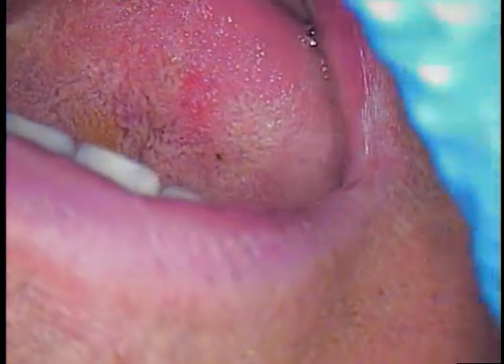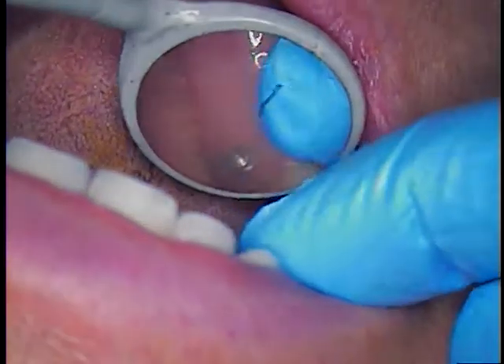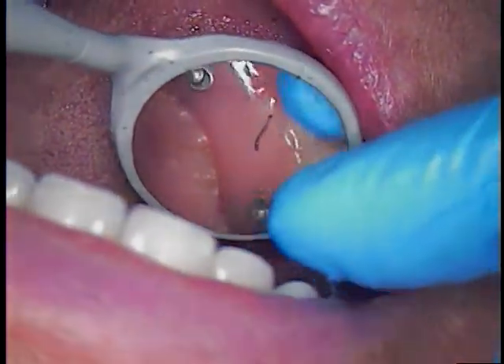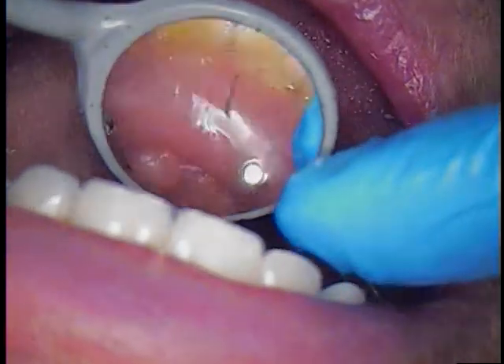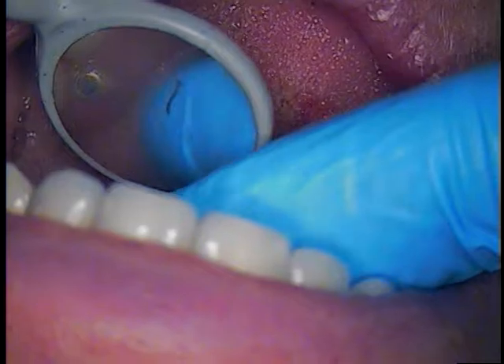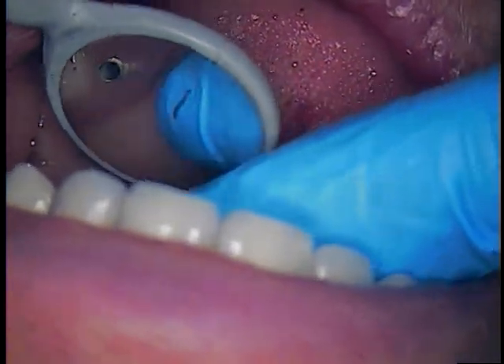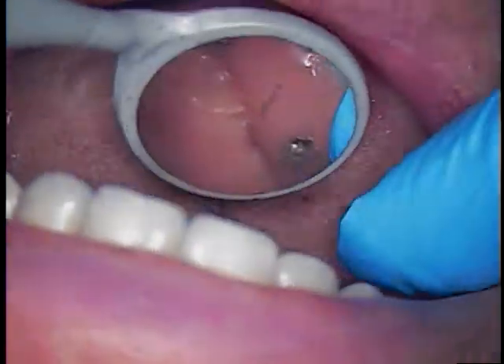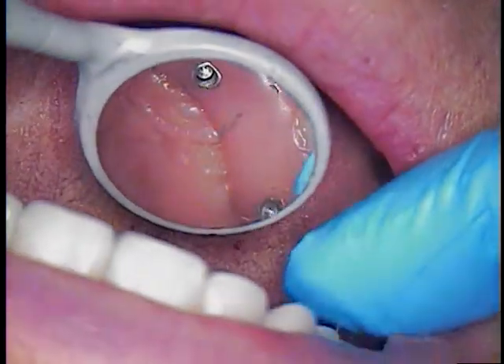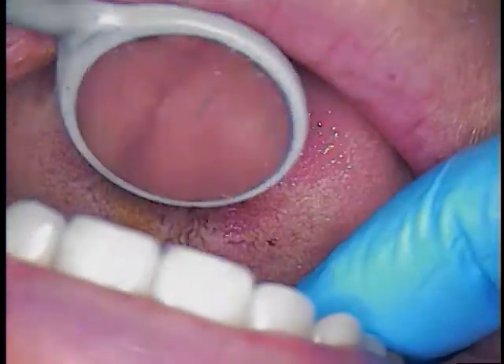I'm back here with our patient, and we did tighten down to 15 newton-centimeters each one of the prosthetic screws for the multi-unit abutments. We found that he had some bleeding — not only bleeding, but some pus coming from both implant sites 4 and 13.